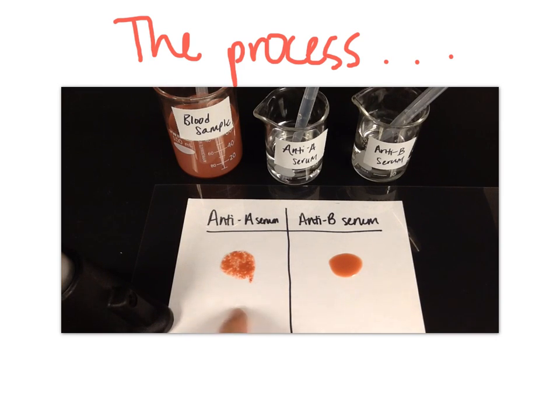If I had clumping on both, then they would be a type AB. And if I had it just on anti-B, they would be a type B. If I didn't have any clumping at all, so both of these look right here, then you would have type O. So that's how you do blood typing.